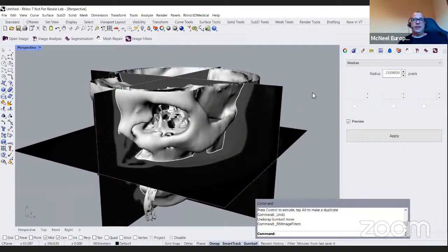Probably you are using another kind of material that is more affordable, right? Yeah. Only for preoperative planning, you can print for sure in resin, in FDM. Then for operation, that's different, and there I still cannot claim anything on that part. Okay. Questions.